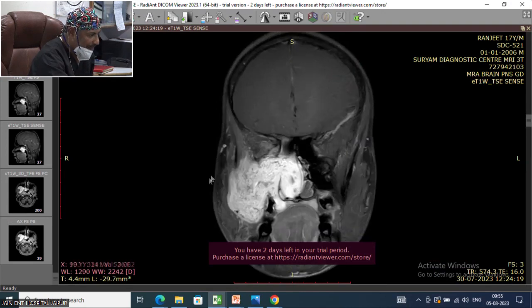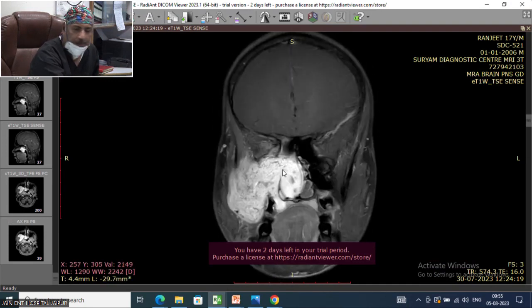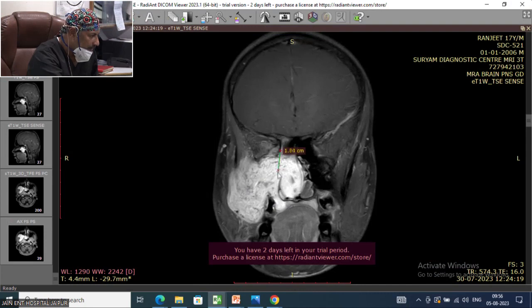That's a huge lateral extension. Can you see this? Yes. So what we are going to do, the nasal space is occupied by this tumor. So what we'll do, we'll go behind and catch this vessel first, number one. And then we will divide, this is the level of the lateral wall of the maxilla here. We'll divide the tumor here at the lateral wall.